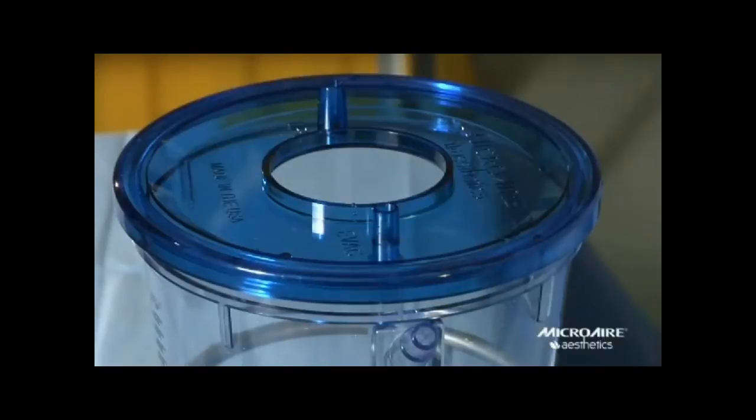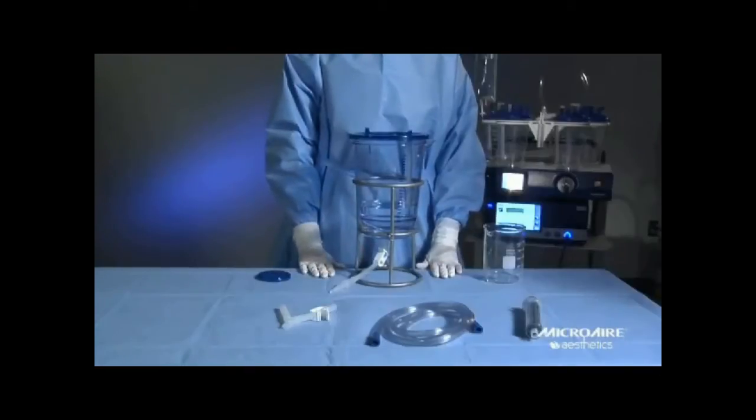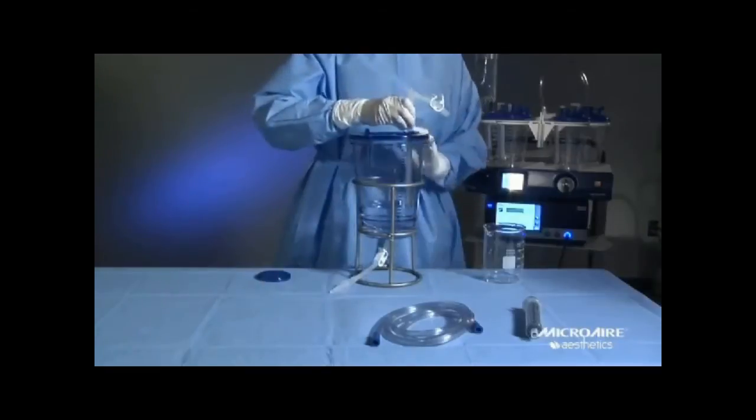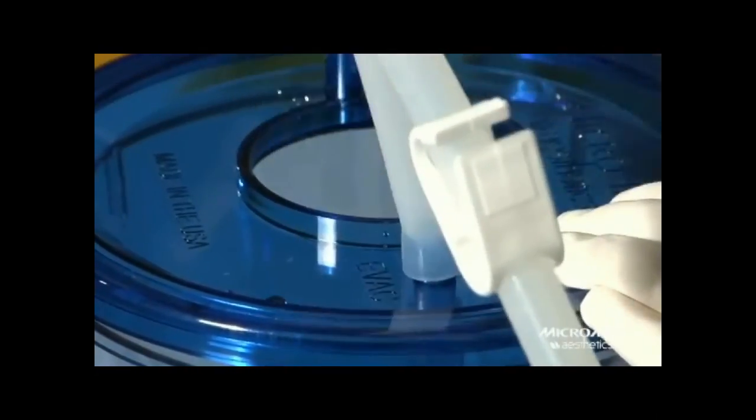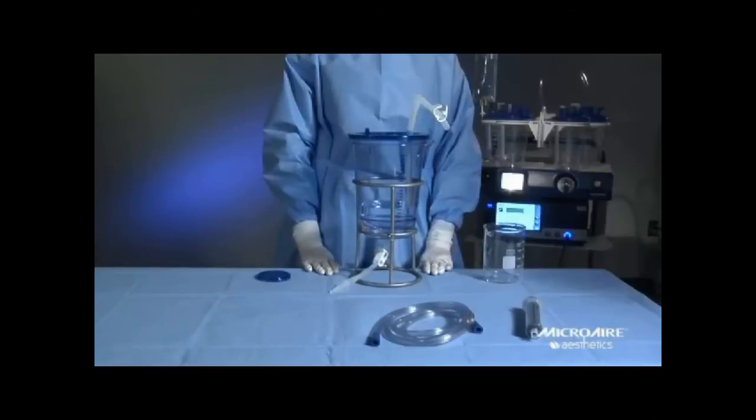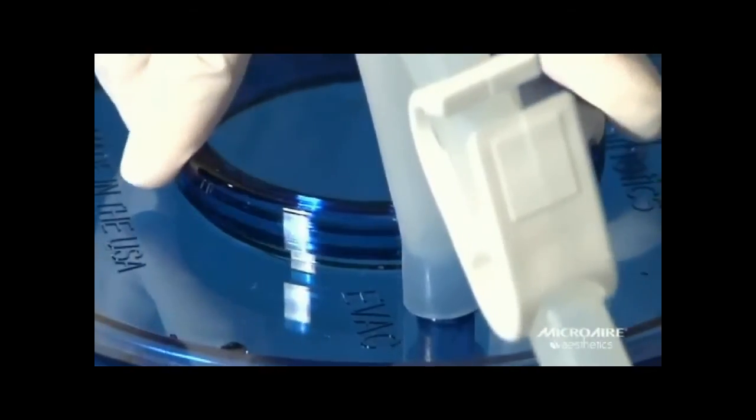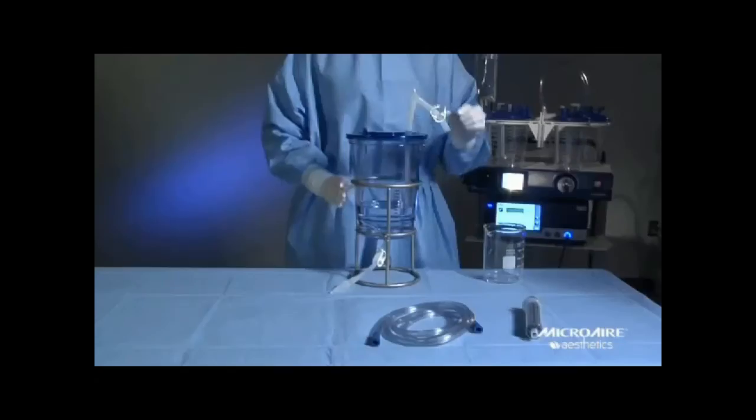Attach the manifold. Place the open tube onto the port labeled evac. You will see it lines up with the evacuation tube that runs through the filter. Secure the center cap. Attach the other tube of the manifold to the side port of the canister marked clamp.